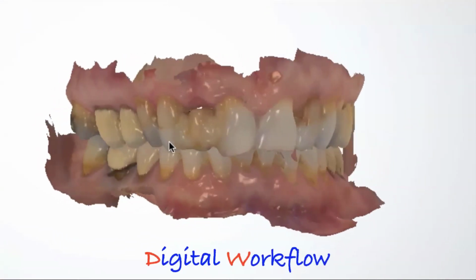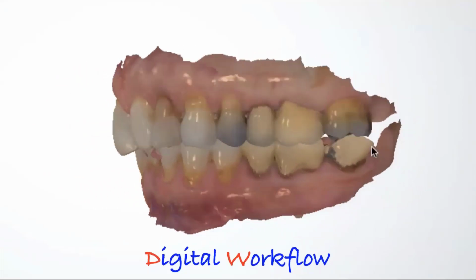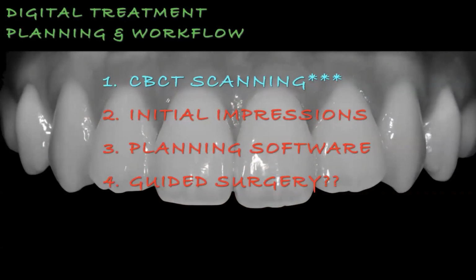So when we take CBCT technology and we take an iOS scan like this and we try to amalgamate them, we can put them in the workflow. And so in this whole patient communication system, we try to take this and put it into workflow. In the next section, I'll talk more about this in detail. But in general, we want to be able to plan a case, whether it's implants or not, and communicate things with our patients. The pink line in this cross section would be the soft tissue, which you would get by amalgamating the CBCT and the digital impression.